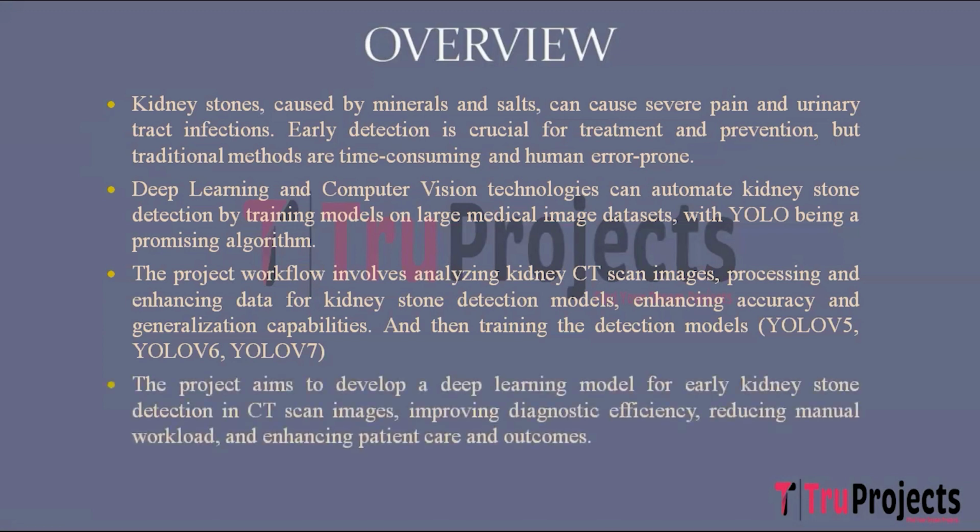And the benefits of the project include early detection of kidney stones leading to timely treatment and better health outcomes, aiding healthcare professionals in making more accurate diagnosis. The primary objective of the project is to develop a robust and accurate deep learning model based on YOLOv5 architecture capable of detecting kidney stones in CT scan images. So, this will improve diagnostic efficiency, reduce manual workload for healthcare professionals, and ultimately enhance patient care and outcomes.